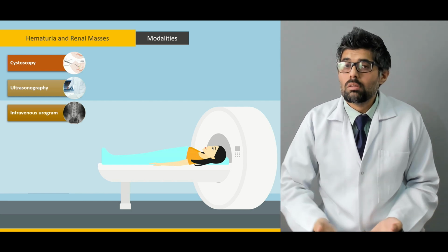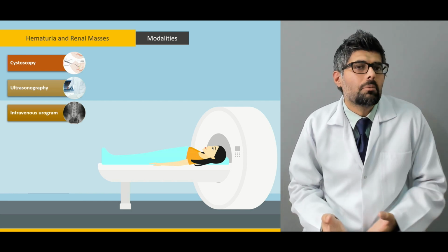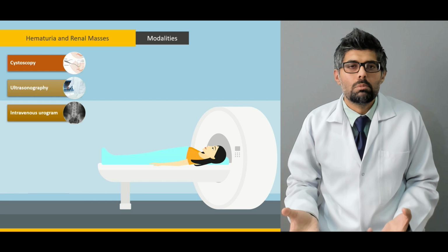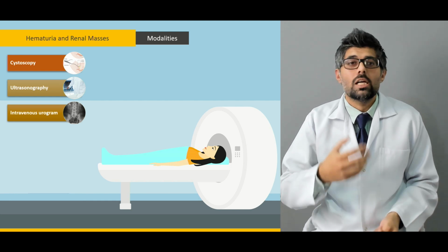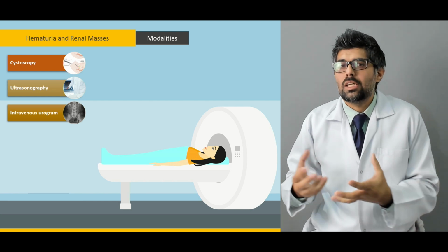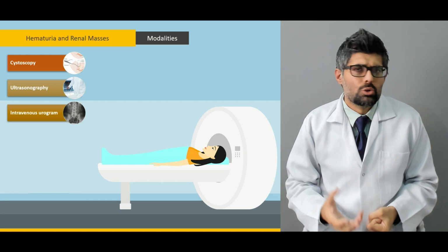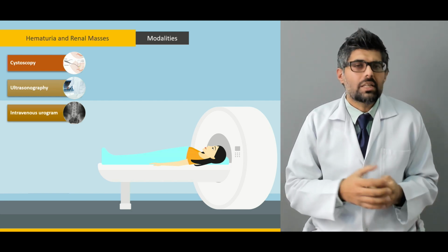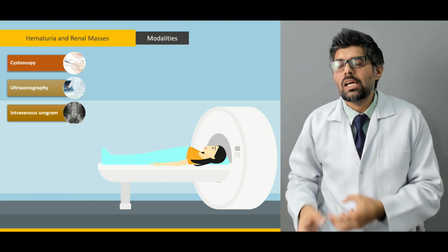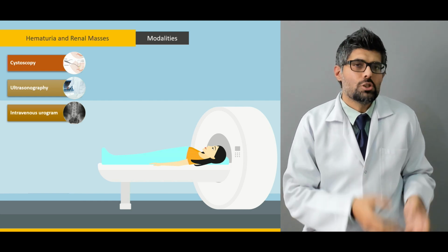Now, urine becomes opacified. If there is any rupture in the urinary bladder, that can be observed. If there is any rupture in the urethra, that can be observed. If there is any kind of filling defect, contour change or kink inside the ureter, even those can be observed with an intravenous urogram.